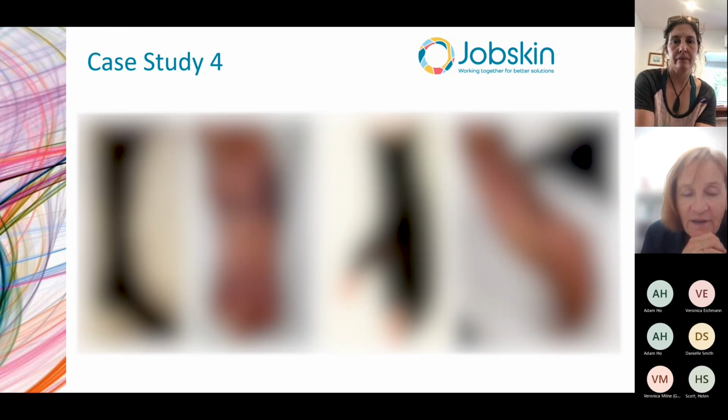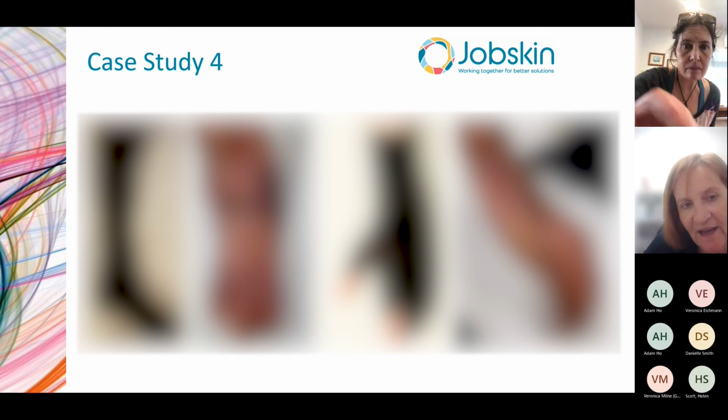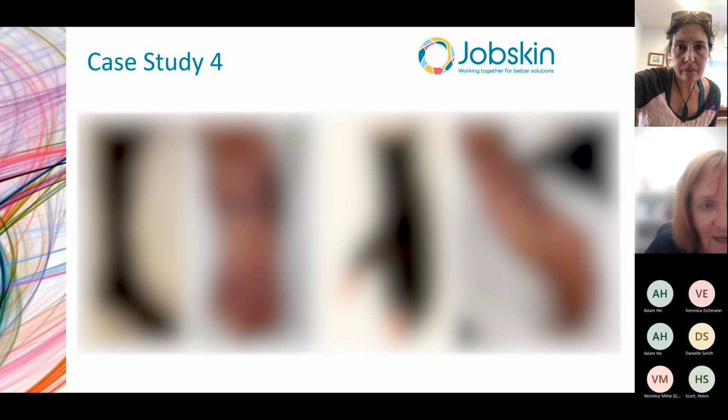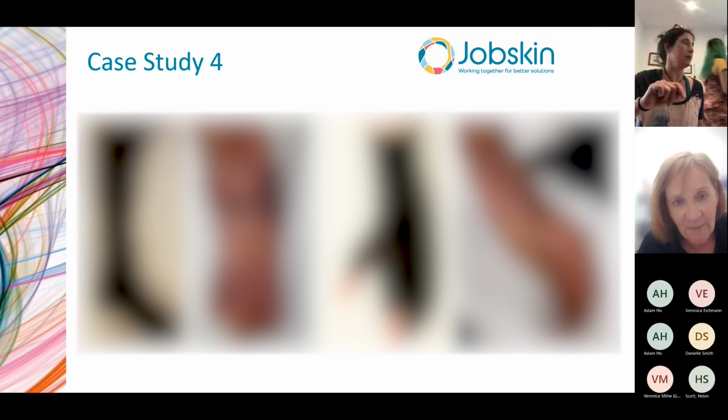So he ended up going into a knee-high sock with a lateral zip. Again, it's black, of course, so it's hard to see, but you can see what a remarkable gain has been made in shaping for that gentleman. His foot looks a bit unusual because he'd previously had amputations of toes because of the gigantism, but you can see on the right-hand side of that foot, there is almost a normal profile for that tissue where that flap has been.